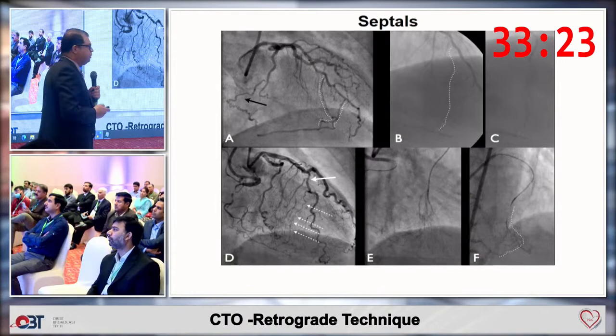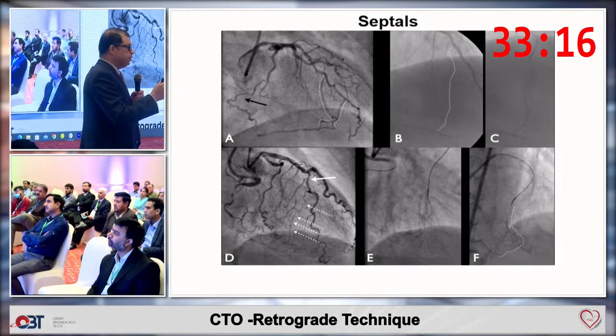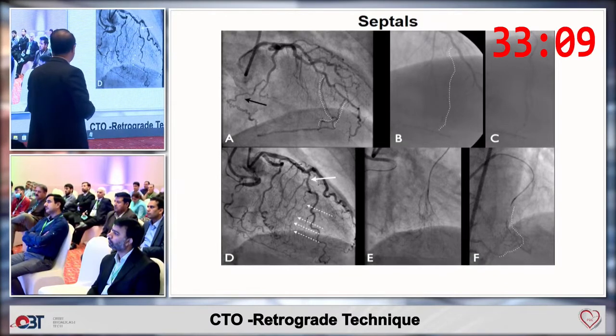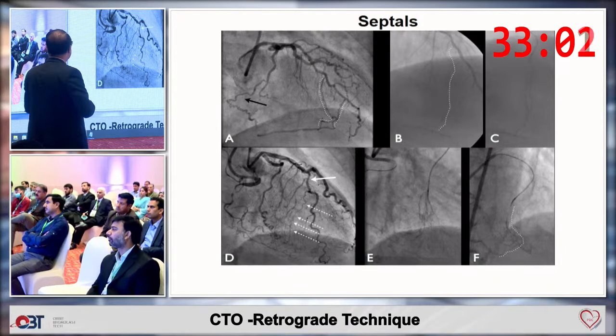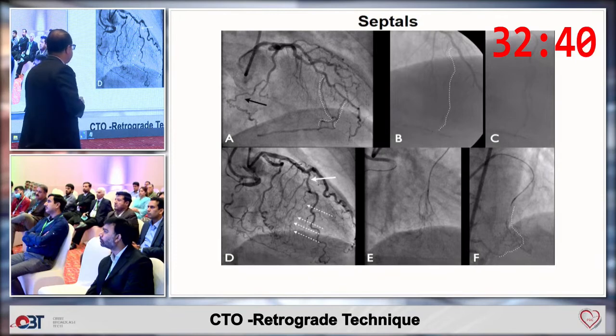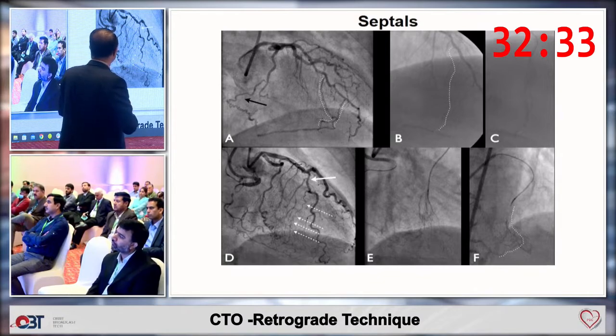So now septal collaterals are probably the safest because they travel in the septum, and even if they perforate, there is a septal hematoma which is usually not very hemodynamically significant. So here you can see the septal collaterals from the LAD connecting to the right coronary artery. Here is a very tortuous epicardial collateral which is also connecting the circumflex to the right, but these would be very dangerous collaterals. So in the presence of septal collaterals, you should not go for these. These should be the last option and only be done with specialized wires, that is SUOH3 wire, but otherwise you can end up in perforation and they are very difficult to treat once they perforate.